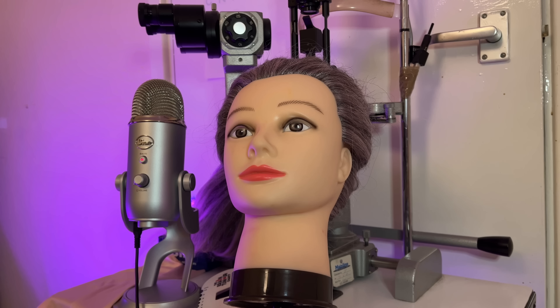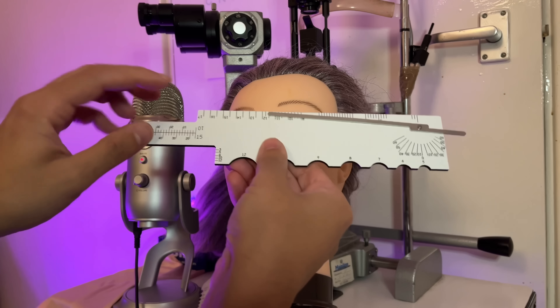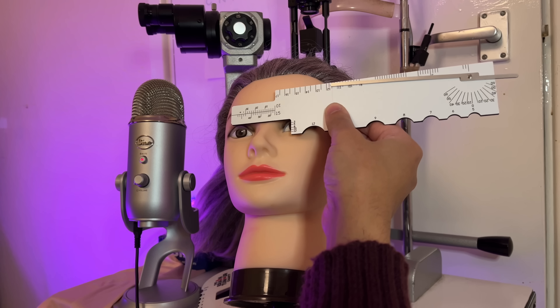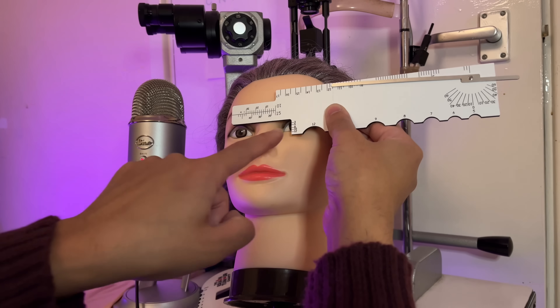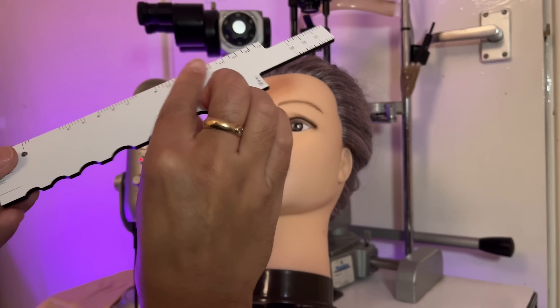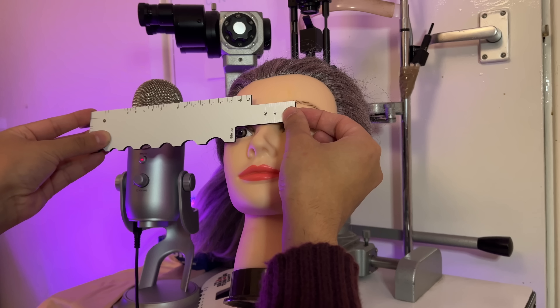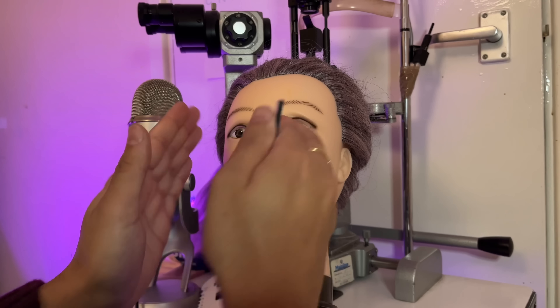Now I'm going to use the measuring device to check the crest height, and we'll be sure to add five millimeters onto the reading. Using this little scale, we hold it like so and measure down to the lower lid — that's approximately eight millimeters — then we'll add five to that for the total crest height. Flip it around: the scale should pass just off or through the pupil center. Nice and steady — we have a reading of 10 millimeters, plus five, giving a crest height of 15 millimeters. So there's a little bit of disparity there.